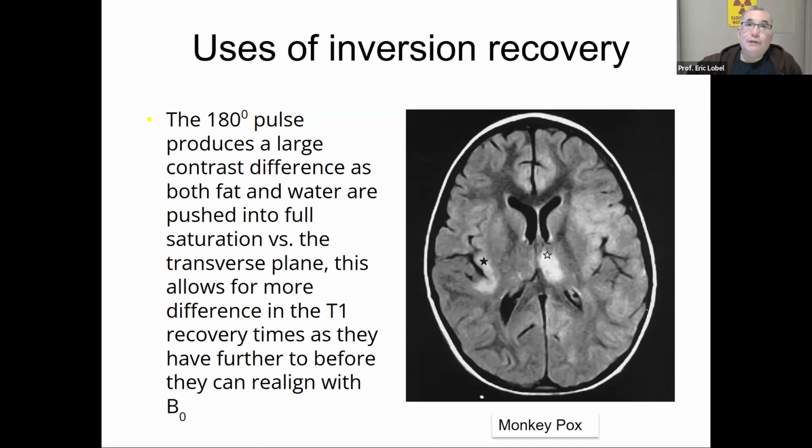Right? So if you're going to use gadolinium, you cannot do STIR. You have to do a different inversion recovery technique that varies by one letter. It's SPIR, S-P-I-R, instead of S-T-I-R. But don't worry, we're going to talk about it because we didn't even get to that.